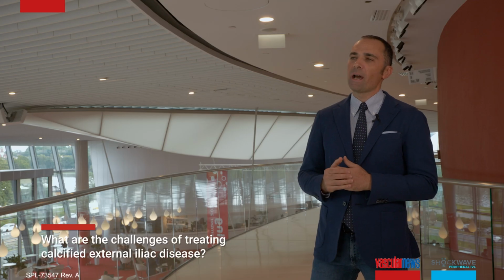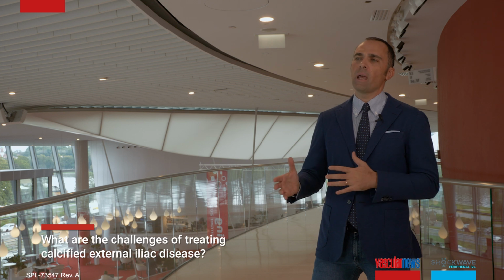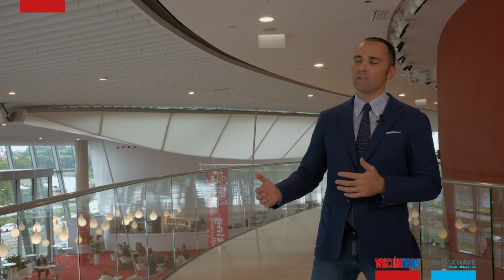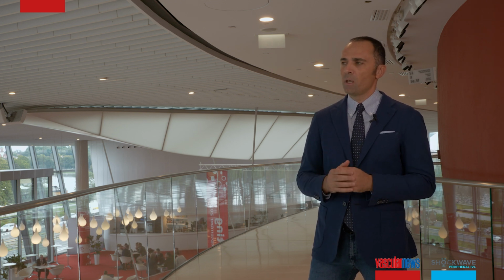Together with the common iliac artery, the external iliac artery represents the main inflow for our leg. And if we consider that most of our patients are chronic patients with multi-level disease, treating the iliac segment at our best is paramount. This segment is very tortuous, has an S shape with a highly flexible point in the distal segment at the level of the inguinal ligaments. And usually for this reason we use a self-expanding stent as scaffolding.